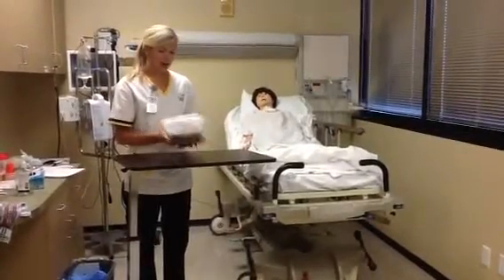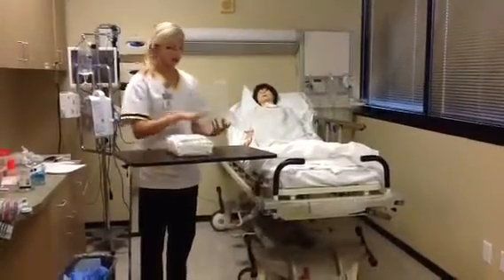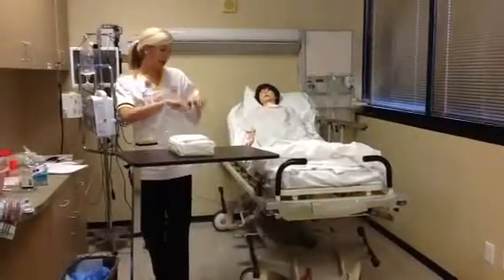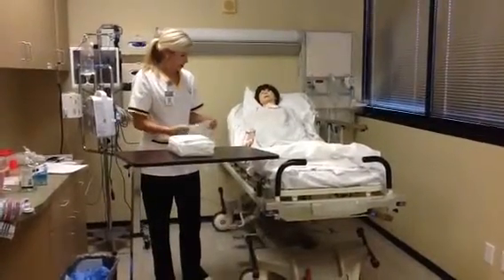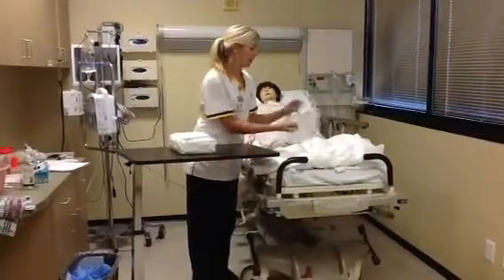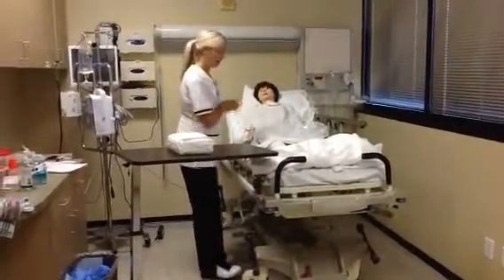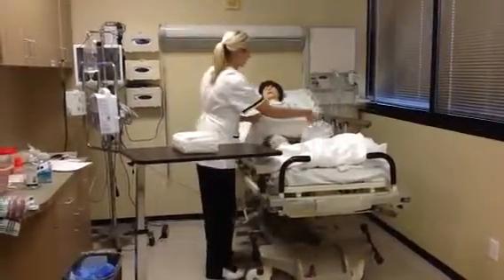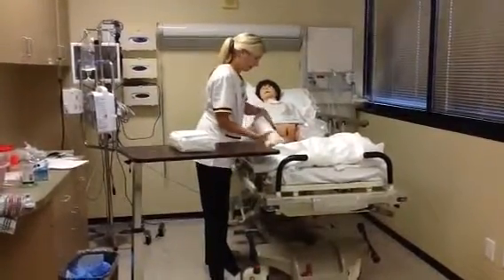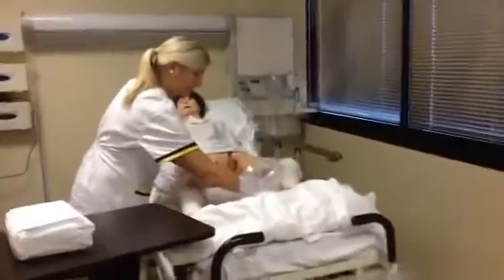So now that I've done that, I'm going to take it out, place it on my surface, and I'm going to make sure that I have a clear, dry surface where I'm going to be setting up my sterile technique. I'm going to take the bag and place it at the foot of the bed, so that I can use it later on for ease. And I'm going to make sure Mrs. Knight is in the proper position to insert the catheter. So I'm going to lift up her gown, make sure her legs have an adequate area.